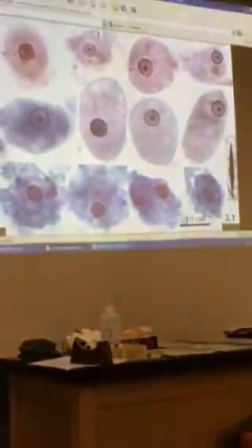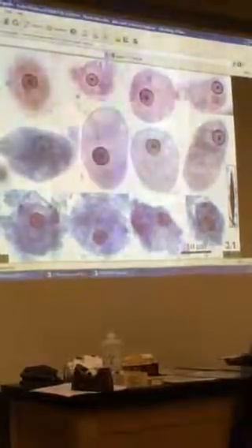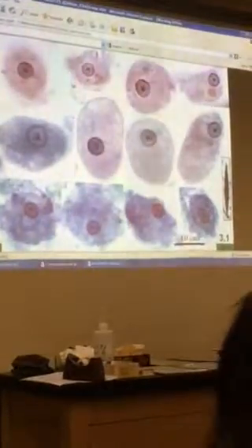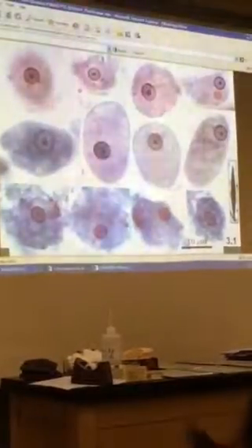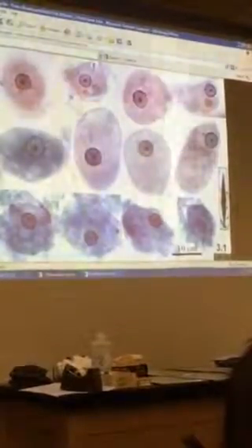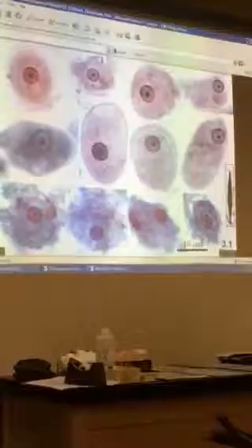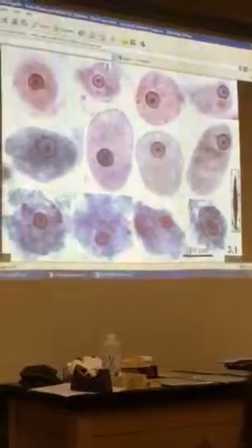Okay. All right, so here are Entamoeba histolytica trophozoites. Here's a 10 micron bar, so most of them are bigger than that. Let's take a look at this table. I'm going to leave the lights on because I think we can see it fine. Trophozoite size of E. histolytica, 18 to 25 micrometers. You're not going to use size very much. Size is not very dependable, especially just looking at one. Usually, except for Endolimax nana, which, when we look over to the right, is a lot smaller. So for E. nana, you'll be looking for something much smaller. That doesn't help us much with these other three that we're looking at.